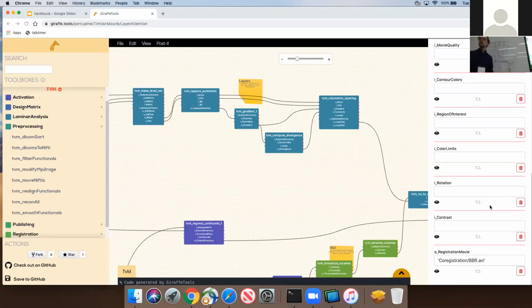Please, by the way, ask if anything is unclear about this. Anyway, there is the question of how to set up that matrix, but let's just for the moment assume that can be done with some of these functions. One of the very important assumptions that you're making is one that John already mentioned this morning.